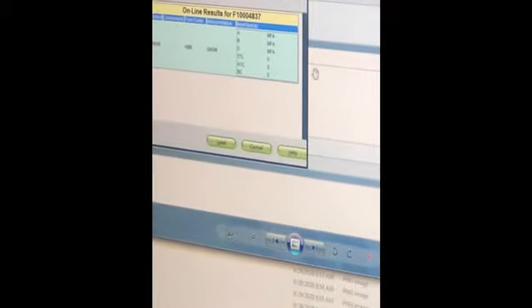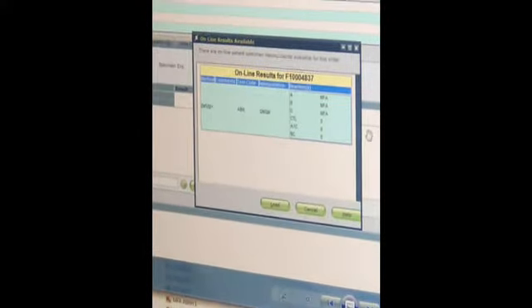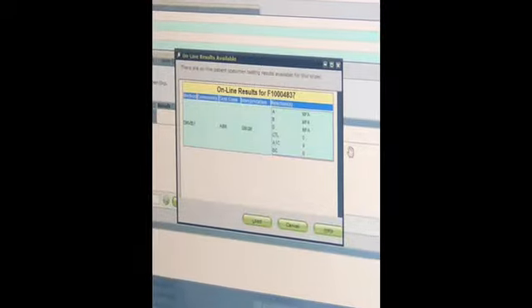Okay. And I wanted it set up that way because I want the tech to be sure when they get mixed field over here that they know the reason why. And once you have that reason why, or even if it's rouleaux, document it and put the reasoning behind it. So if we get the mixed field in our three, we need to repeat it. You gotta figure out why.